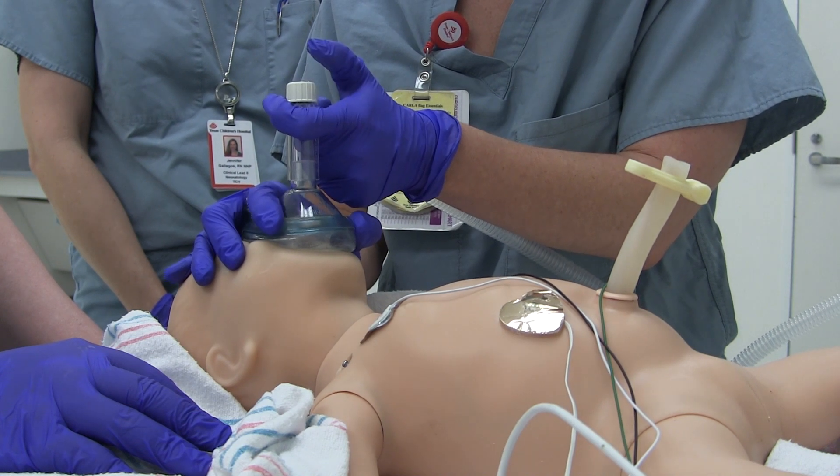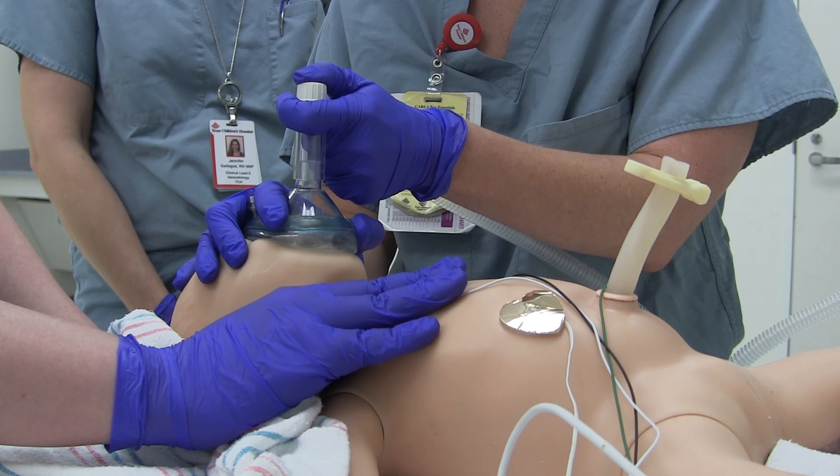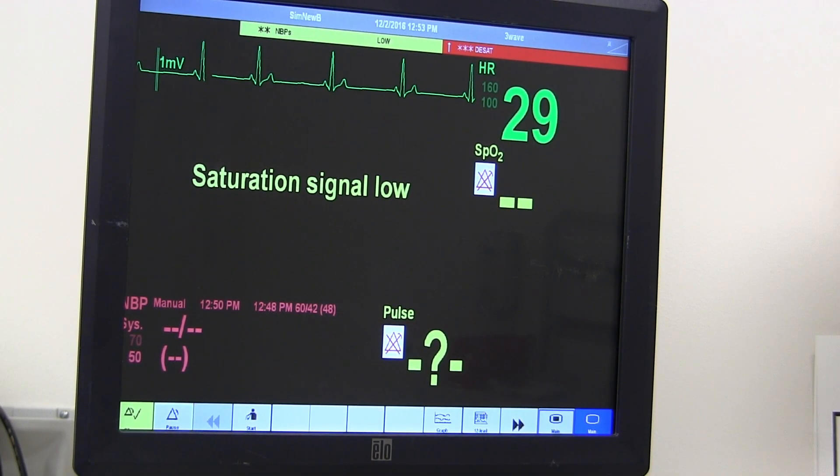After the initial steps, this baby was assessed and required positive pressure ventilation. Bag mask ventilation has been moving the chest, but the heart rate is not increasing.